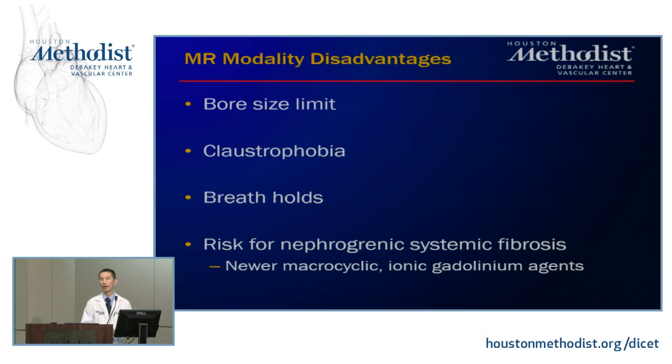As I mentioned, not everyone is a great candidate for a cardiac MRI, so if the patient's too wide for the magnet, then they can't get a cardiac MRI. They won't be able to fit into the magnet, and unfortunately, we can't change the laws of physics and space. If they're claustrophobic, obviously they wouldn't be a good candidate because it is a pretty confined area. I'm talking about a 60 centimeter bore for the 1.5 Tesla magnets and a 70 centimeter diameter bore for our 3 Tesla.